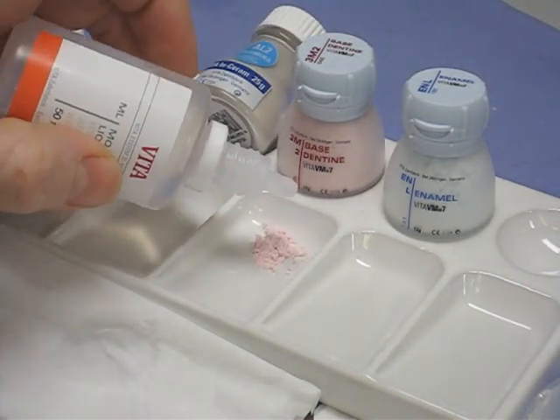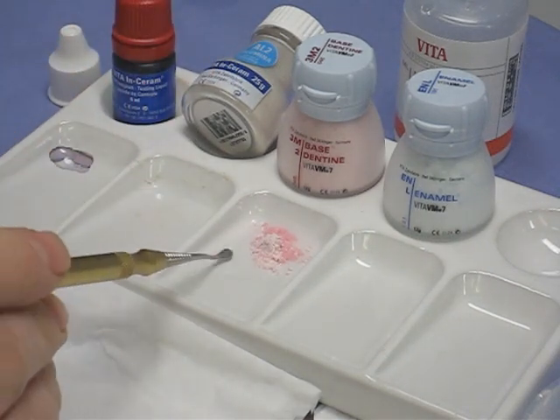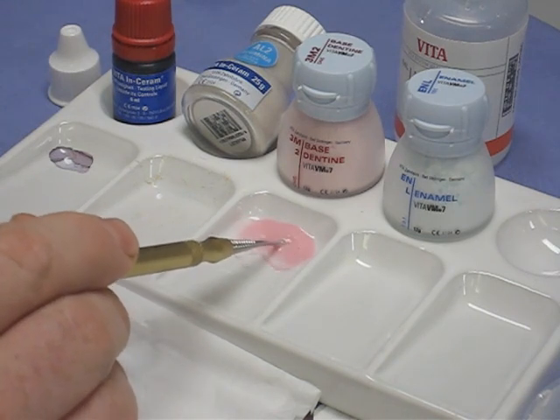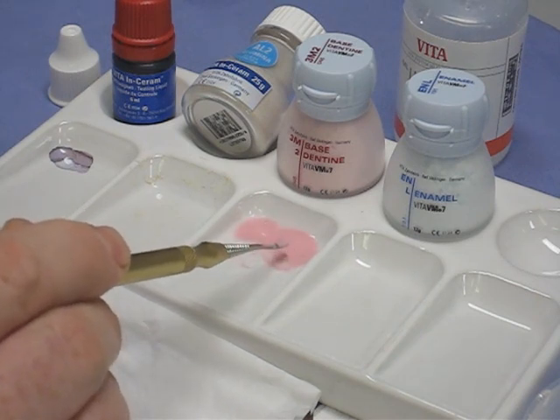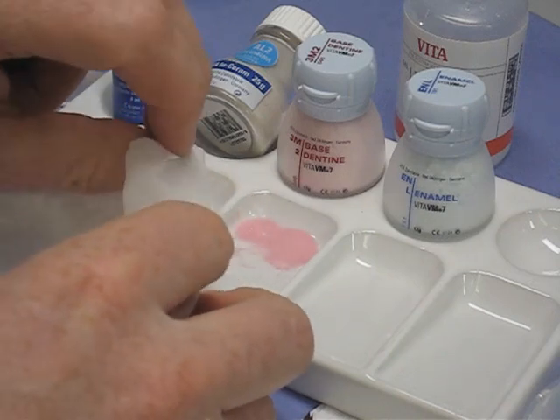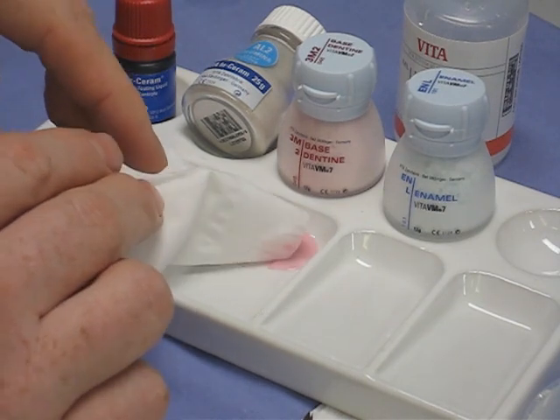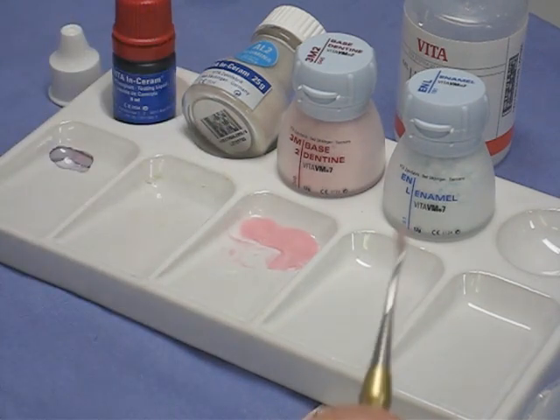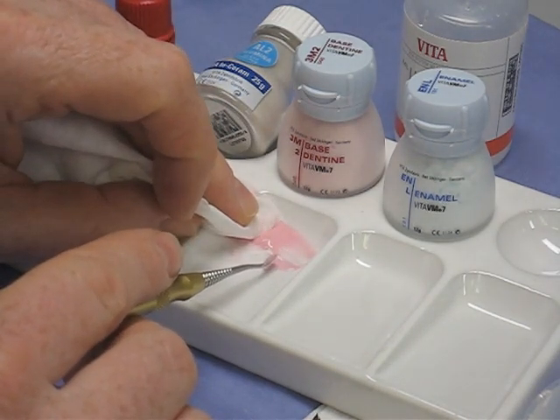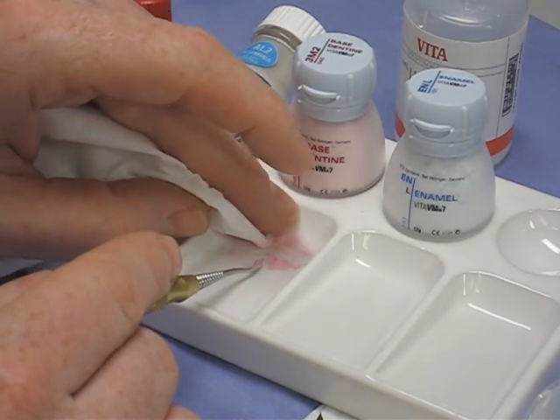The ceramic is mixed with the modeling fluid — just a small amount. When mixing ceramics in the palette we use a special instrument, not just any lacron, because we don't want metals in the material which would discolour it on firing. We use either a glass rod or a special ceramic instrument. If you've added too much liquid, blot the excess out — don't keep adding more powder, as these materials are ridiculously expensive. We're aiming for the consistency of wet sand: not too wet so it slumps, not too dry so it falls apart.